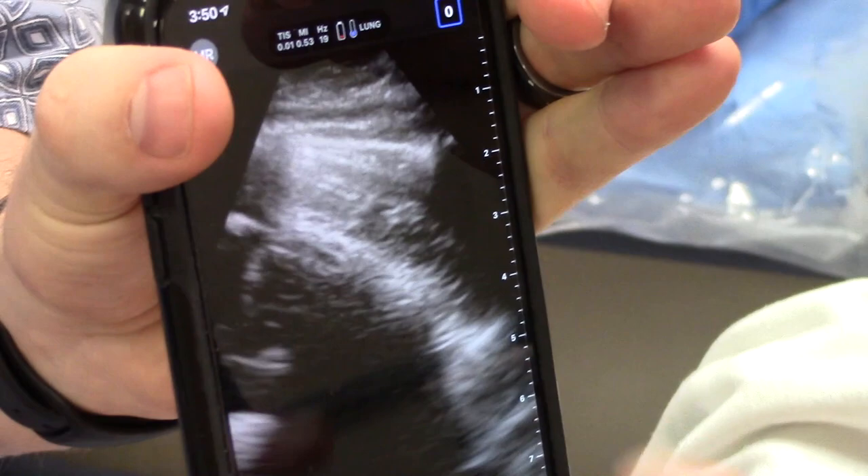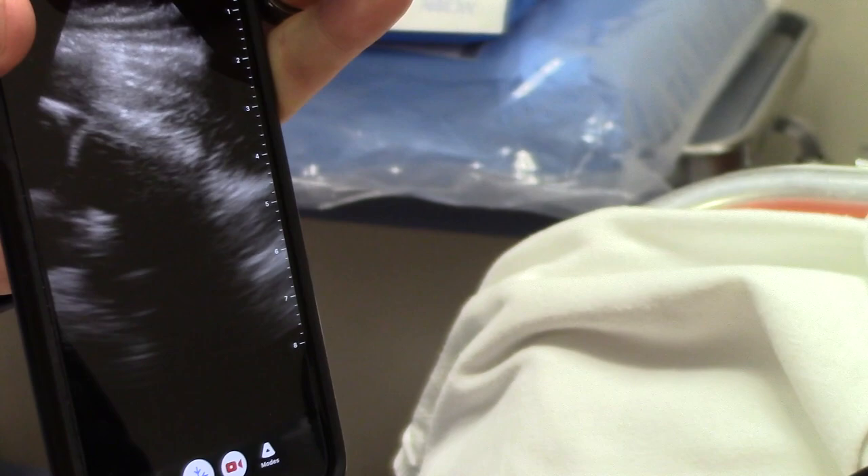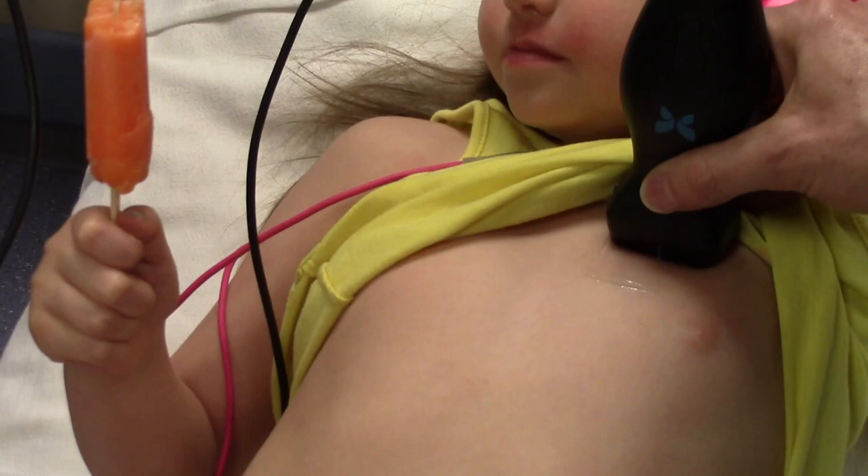If the position that she is in right now, I'm in the most superior aspect of her lung field. And if I was looking for a pneumothorax there, I would be looking for an absence of lung sliding — and not that beautiful, shiny, white, sparkly pleura that we're able to see right here.